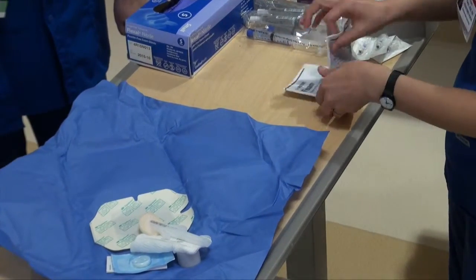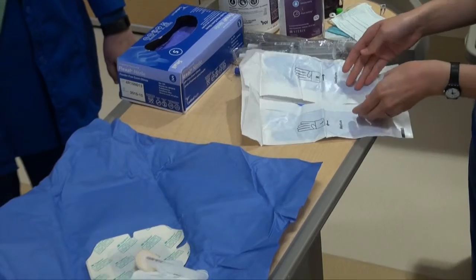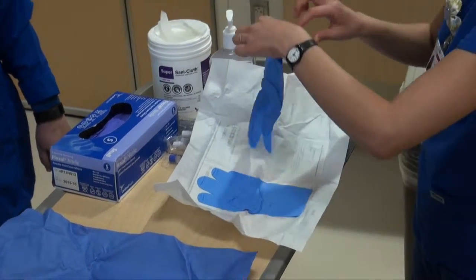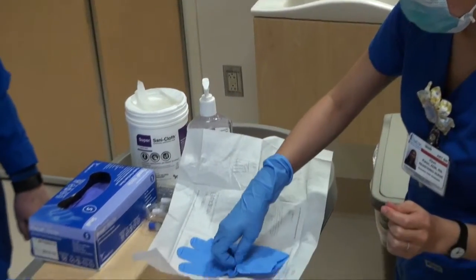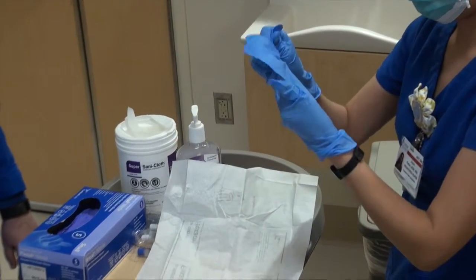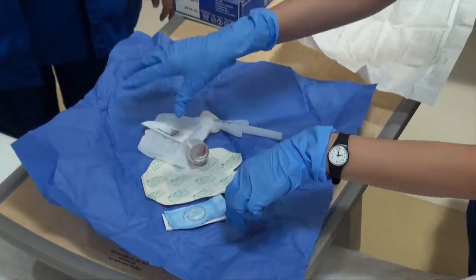Put on your sterile gloves. You want to set up your sterile supplies, open the BioPatch, and have everything ready to begin the dressing change.